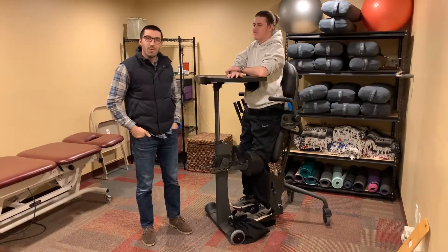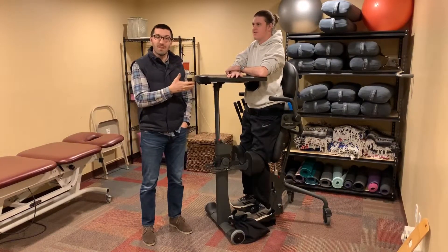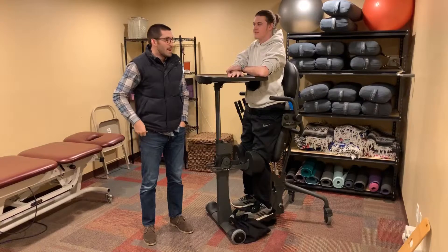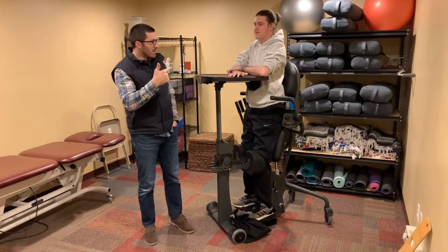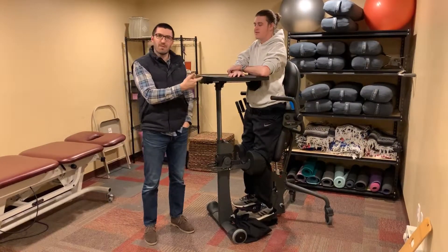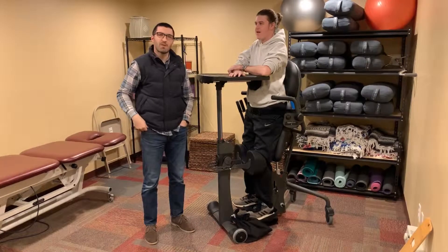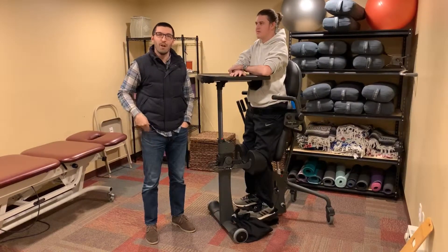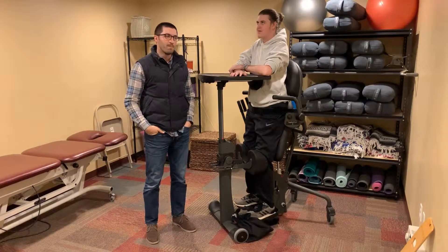Trev and I are just going to show you a setup using a stand table today. We're going to go through a few points of adjustability with a stand table and some things that are specific to Trev, but that also might be helpful to other folks out there as well.